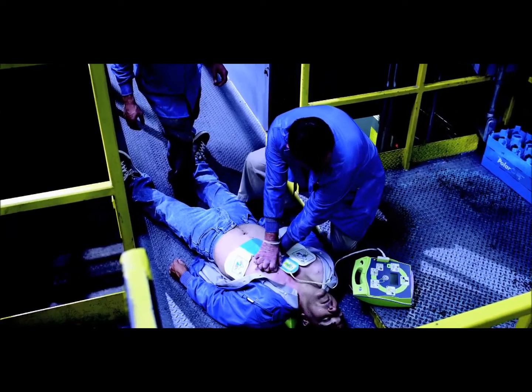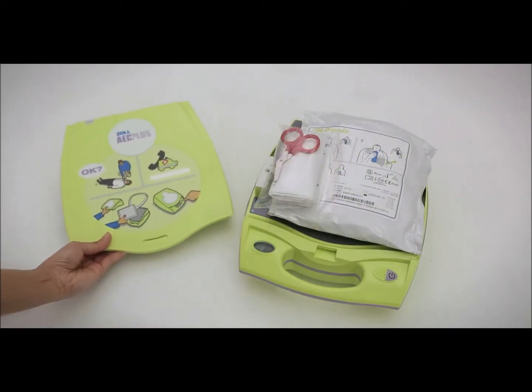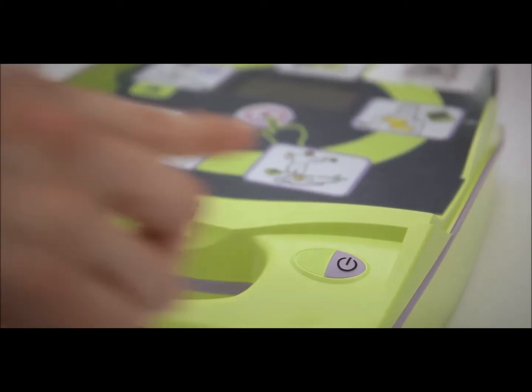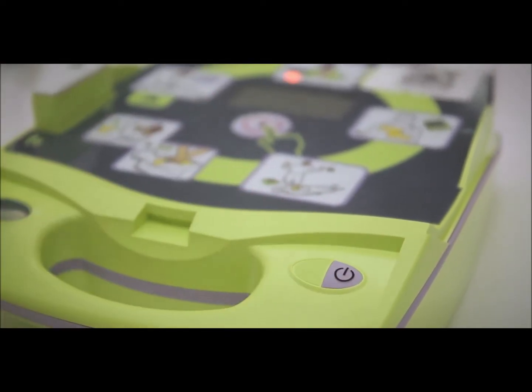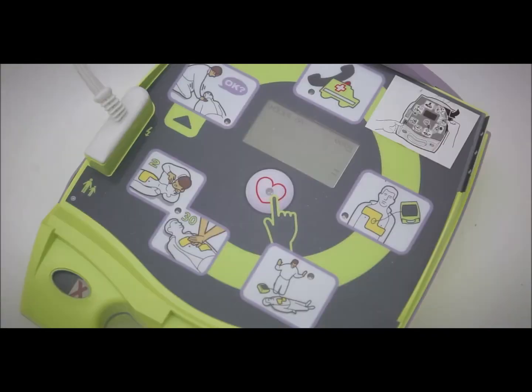During a sudden cardiac arrest, here's what we will do. Once the AED is retrieved and reaches the victim, open the AED's lid. Turn on the AED, following the audio and visual prompts throughout the rescue process. An LED light will indicate what you should be doing.